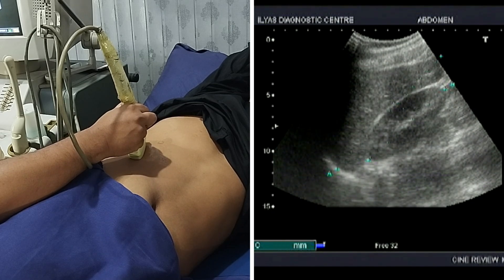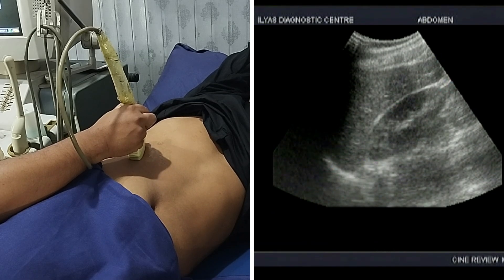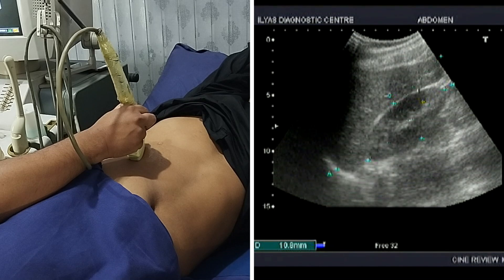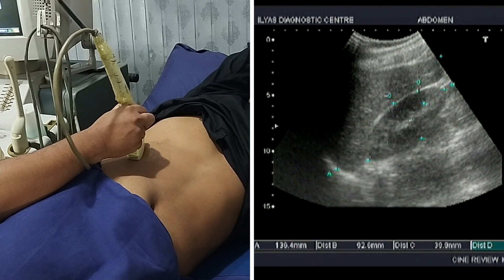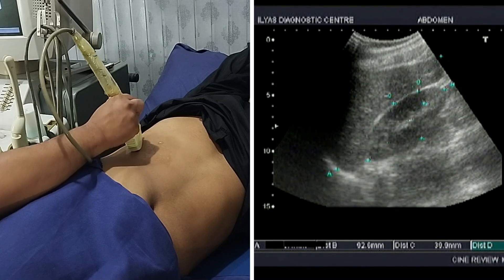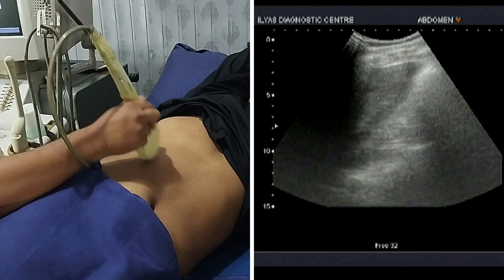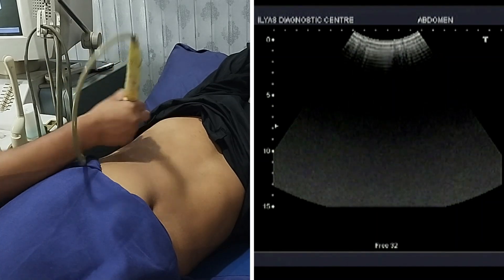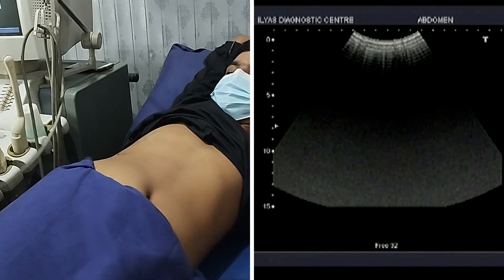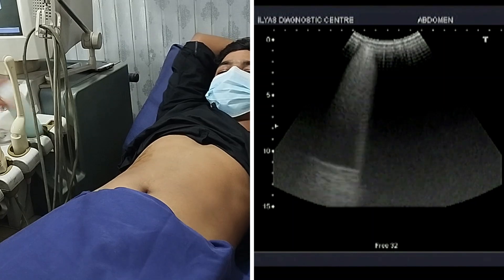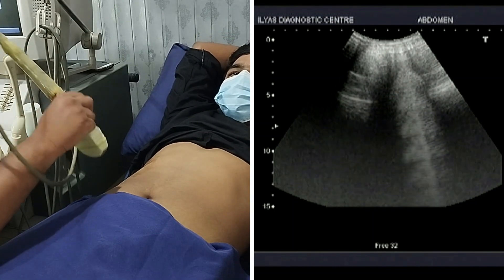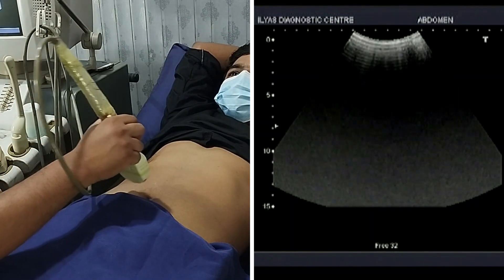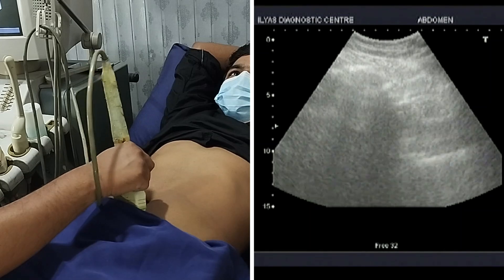I will take the measurement for the liver, then I will focus the kidney and take measurements for the kidney: length, width, and cortical thickness. Then I will ask my patient to lie straight again.